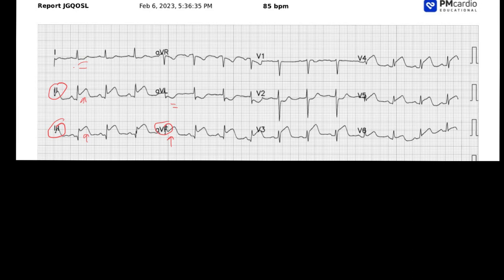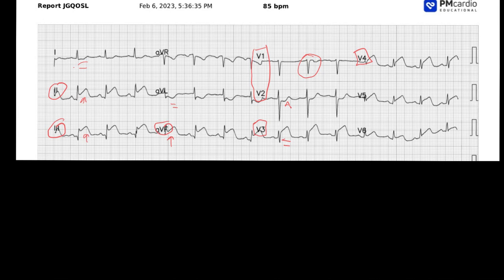Let's move on and analyze the rest of the 12-lead ECG. Looking at our septal leads, V1 and V2, we've got a little bit of depression in V2, and in V1 we have slight interesting changes — maybe a little bit of elevation. Moving on to the anterior leads, V3 and V4, we notice pretty substantial ST elevation. Then moving on to the lateral leads, V5, V6 — we also see ST elevation in V5 and V6.